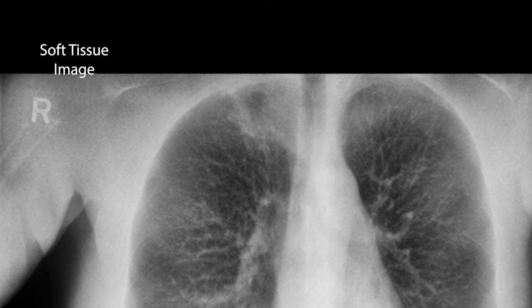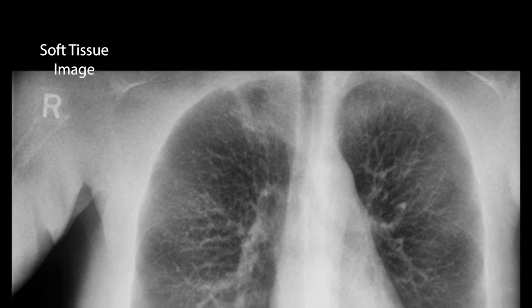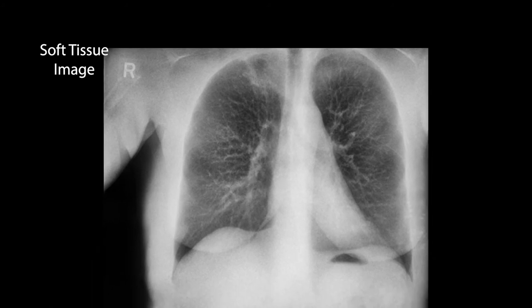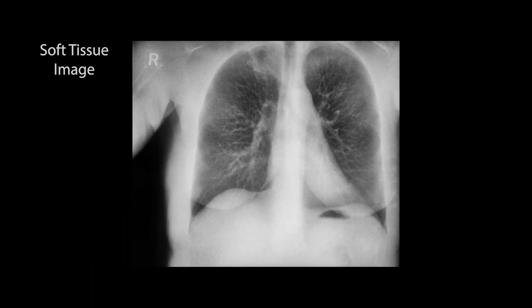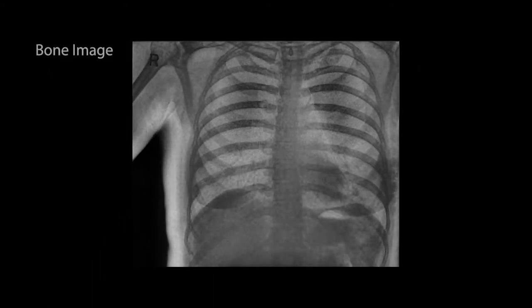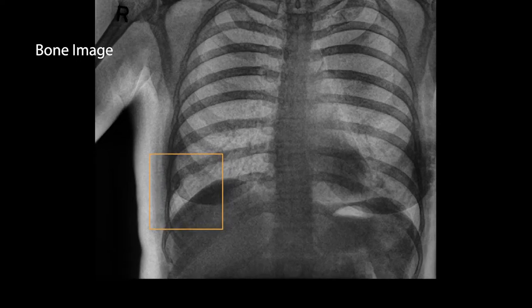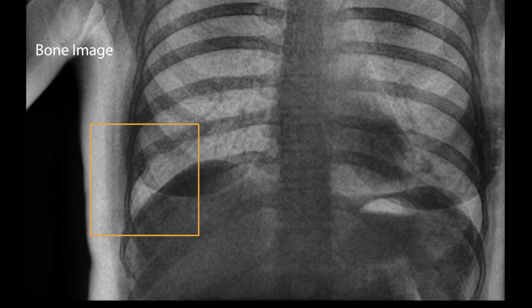The lesion seen in the soft tissue x-ray image was confirmed using a CT scan to be a mass. In addition, the radiologist also queried an old rib fracture that now became visible on the right side in the bone dual energy x-ray image.